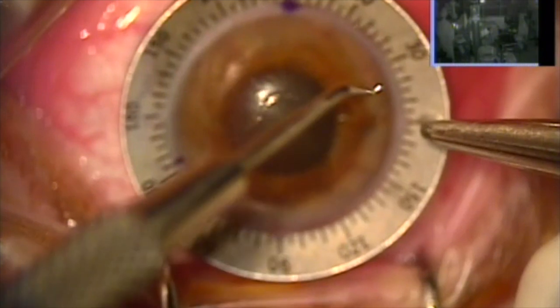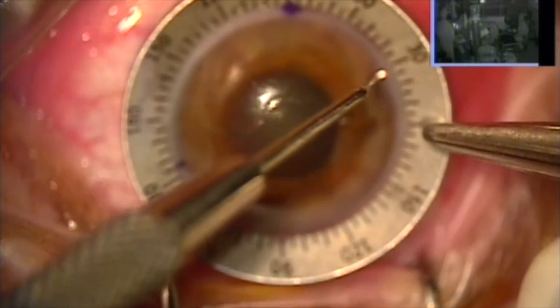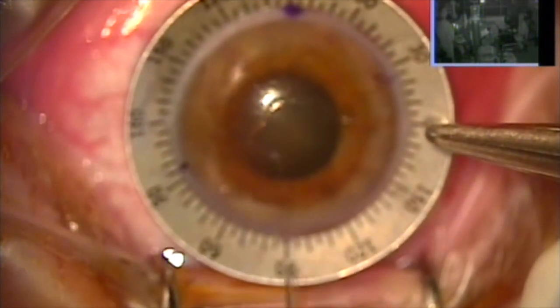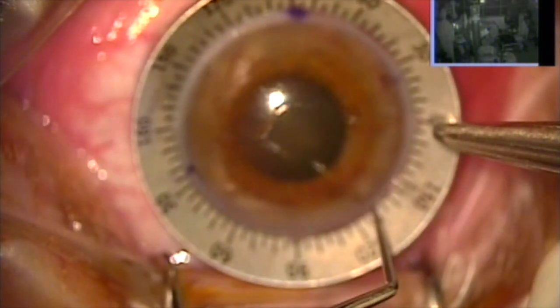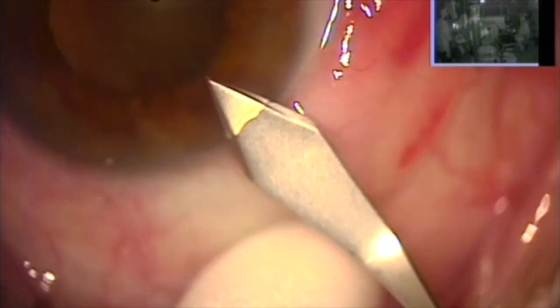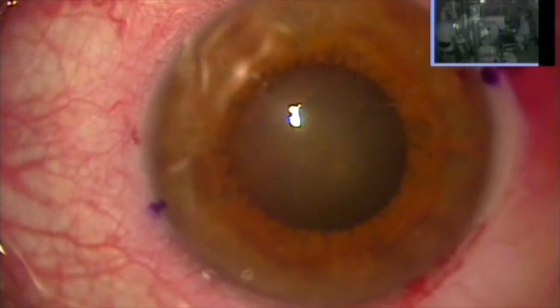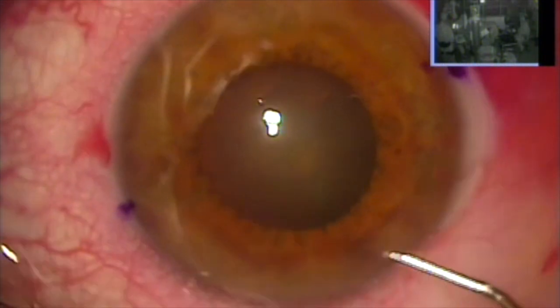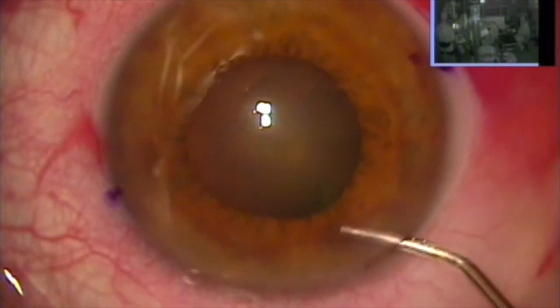Best corrected visual acuity is 20/200. So we're marking our astigmatic axis here at 25 degrees, my incision at 135 degrees. This is our beveled incision at 135, and we'll do a paracentesis just one millimeter. There is a small pupil despite cycloplegics.